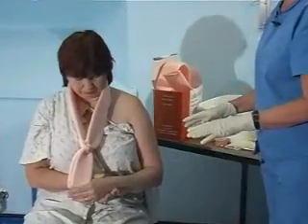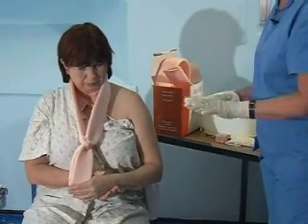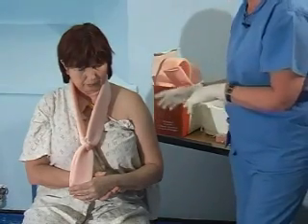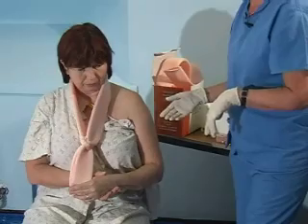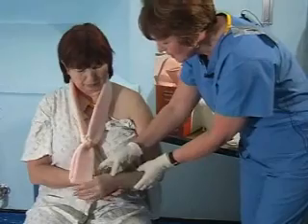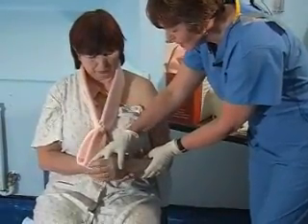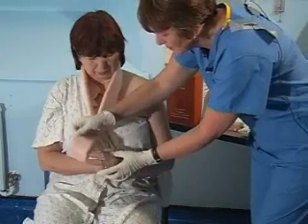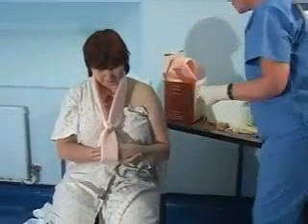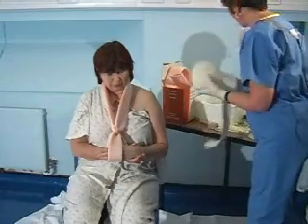Before I put the plaster on I must check if there are any neurological defects or any nerve damage. Because putting the plaster on could cause radial nerve damage by compression. So I'm going to check first — can you lift your wrist up and down? And she can. Can you move your fingers up? There's no wrist drop, so it's fine. I can make a note that at the time there was no wrist drop, because the radial nerve is very prone with humeral fractures.